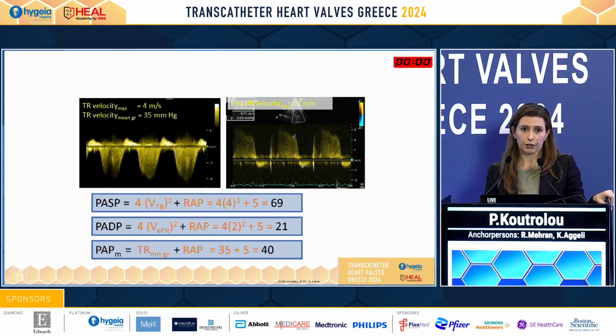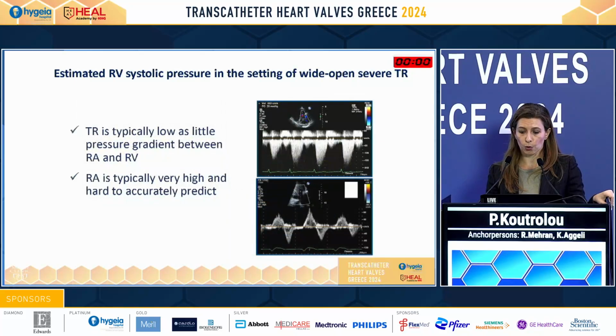Again, via echocardiography, this is an assumption. We make the best we can, and as Dr. Kourkoveli said before, in people who have severe TRs, pulmonary hypertension, dilated RV, there is a question mark about what we do with those patients. We always want to do right heart catheterization.